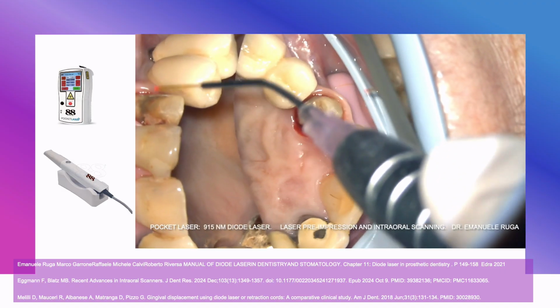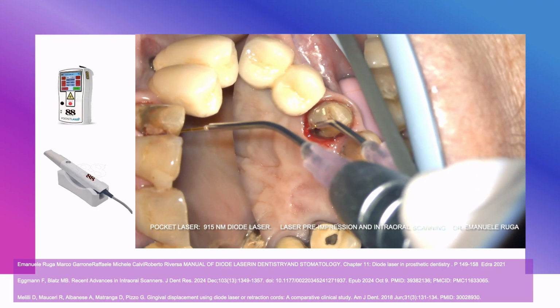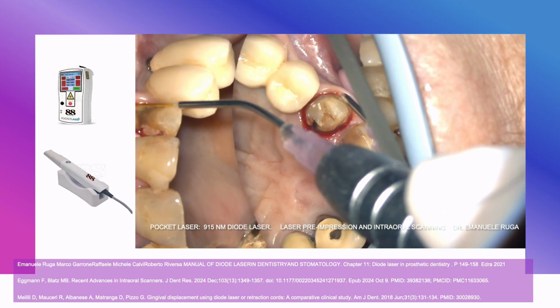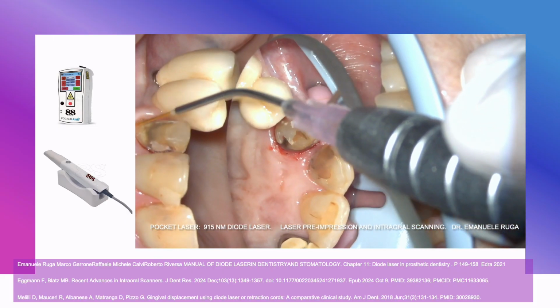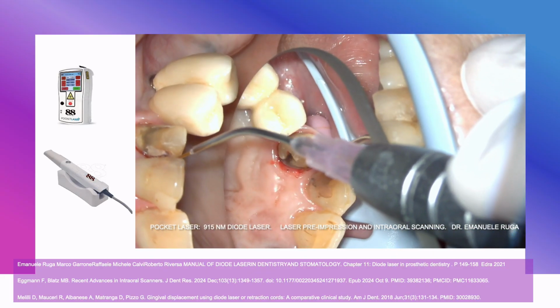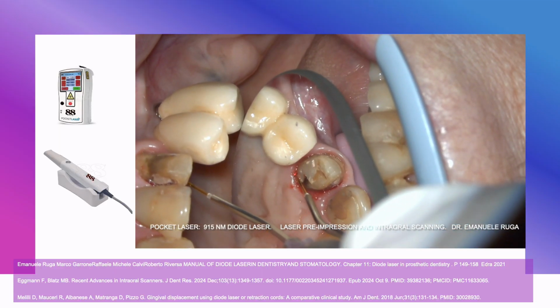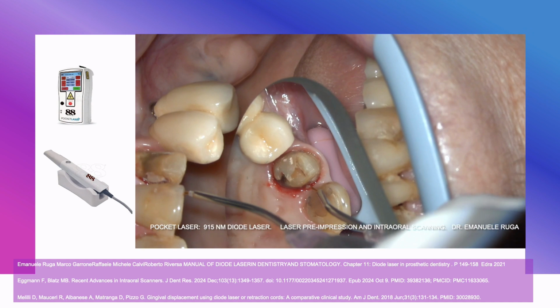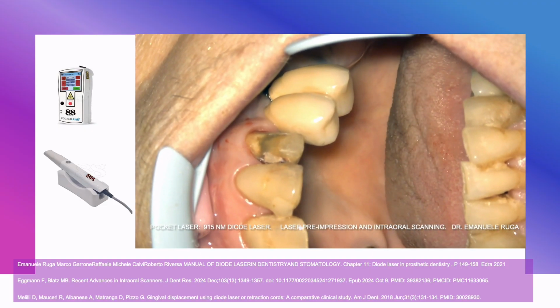As introduced before, we can clearly understand how much laser technology has affirmed its presence in various fields of medicine and stomatology. Another important synergy certainly exists with modern digital techniques and technologies, such as intraoral scanner impression and smile design software. Patient comfort with intraoral scanner procedures, we know, is favorable, mitigating the discomfort associated with conventional impression taking. In oral and maxillofacial surgery, intraoral scanners enhance airway safety during the impression taking.